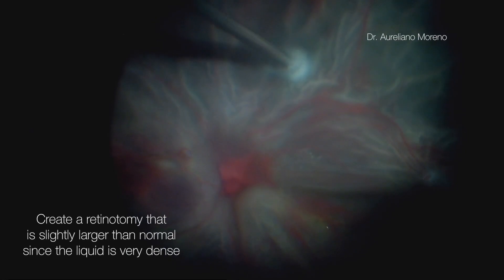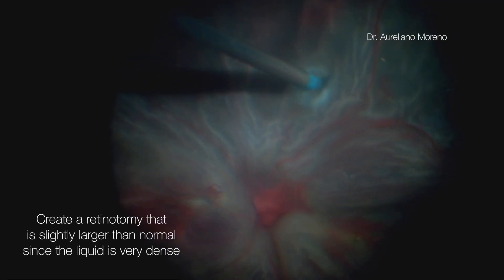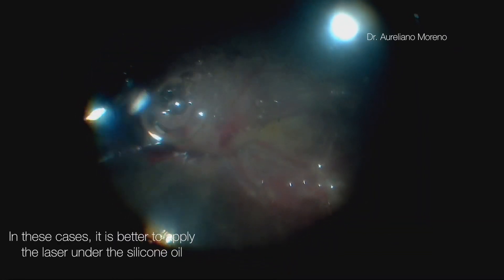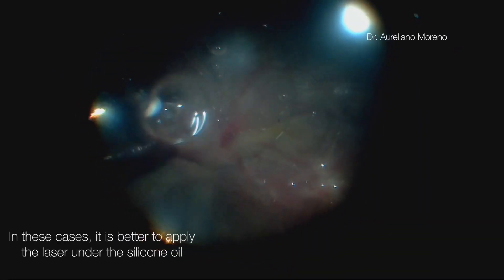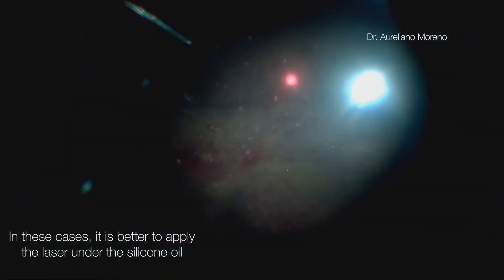After removing all the vitreous and tractions, the surgeon performed a retinotomy to aspirate all the dense subretinal fluid. The use of perfluorocarbon liquid was unnecessary in this case, and after a silicone oil injection, pan-retinal photocoagulation was completed.